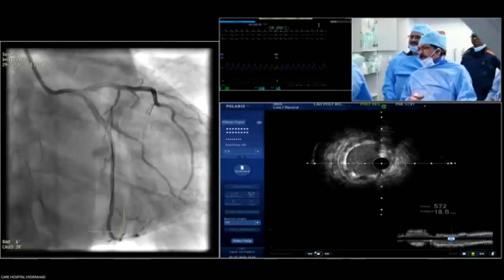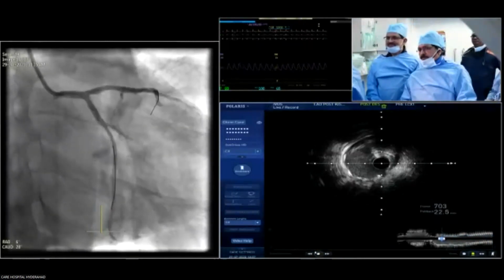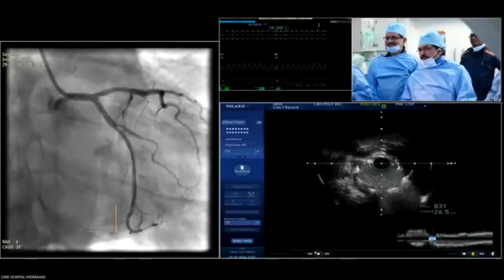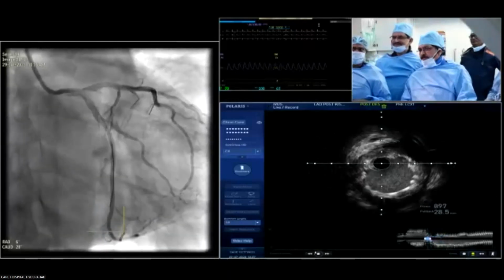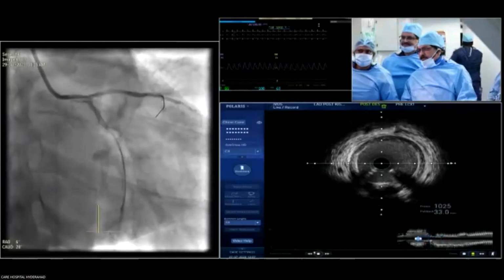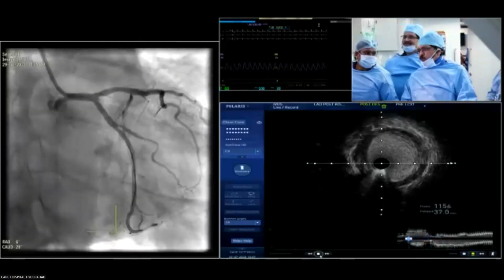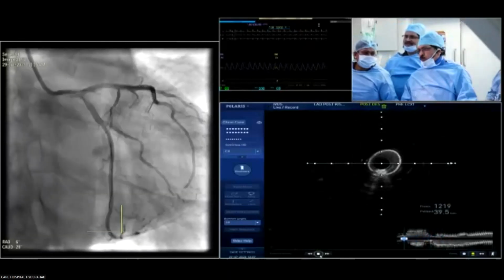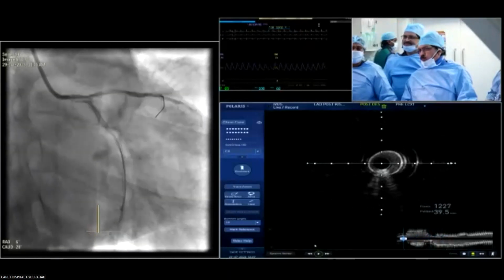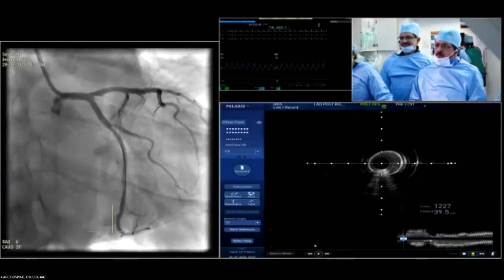The distal landing zone was beautiful. And it appears to be reasonably well expanded. It would be worth measuring the area because we're right there, for example, because we're shooting for 5.5. So here you see that your stent actually comes back to the distal left main, right? It has crossed over, and it underlines the importance of the fact that carinas and bifurcations are not well assessed on just angiography. So you actually do have a stent across the carina and ending in the distal left main.